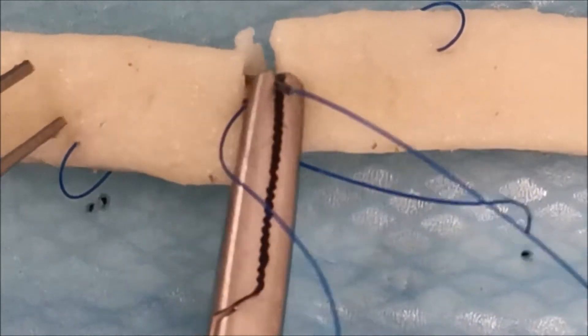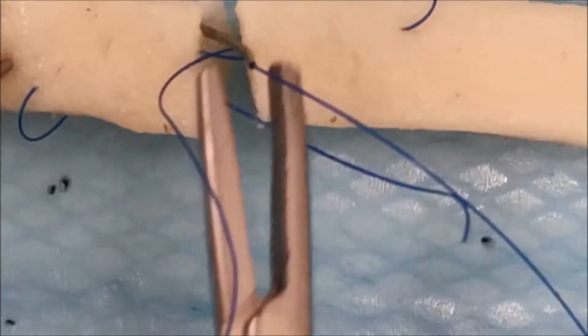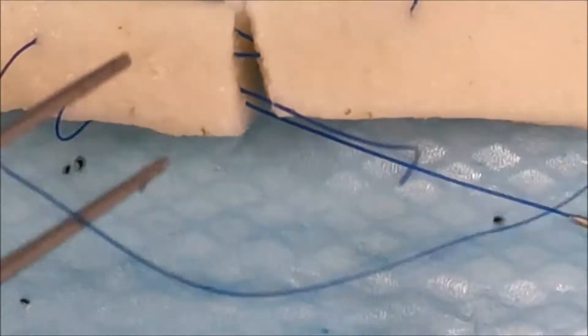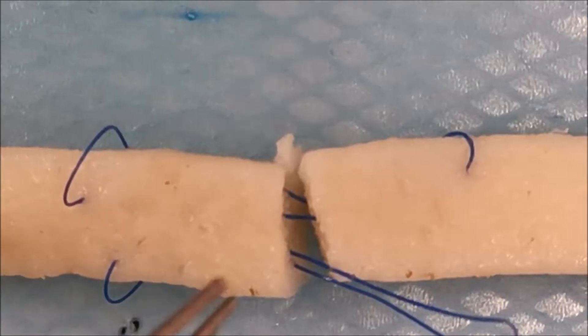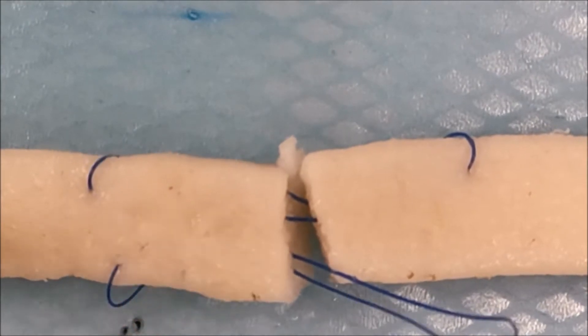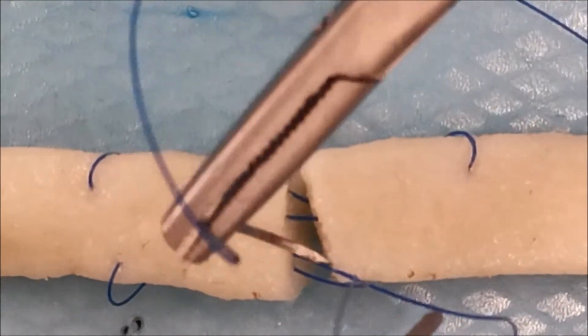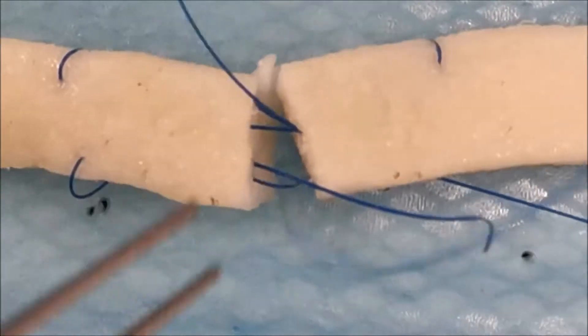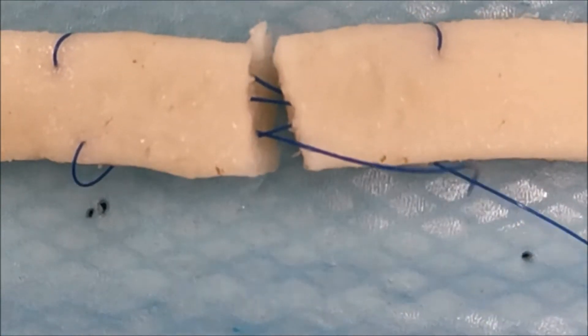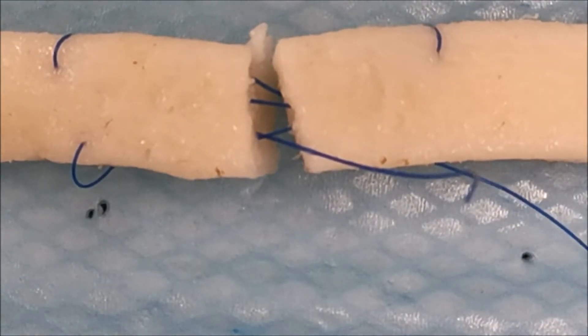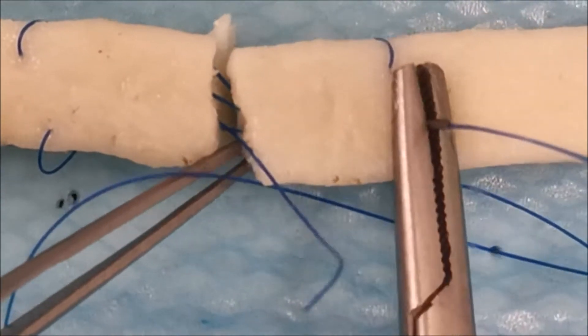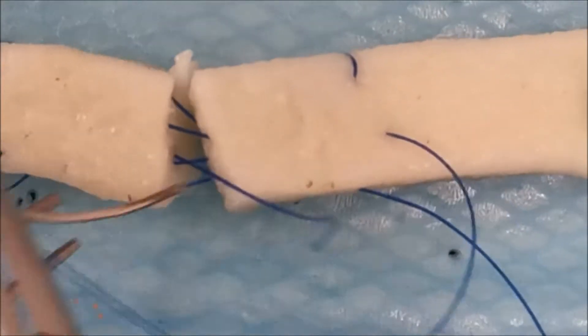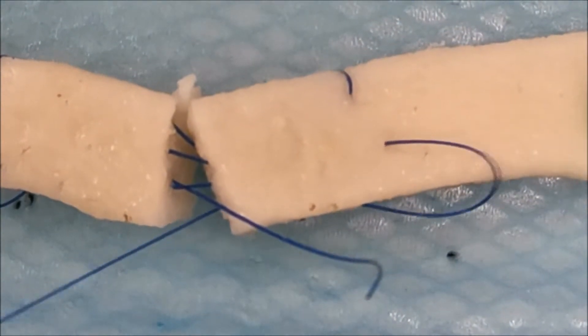The same is done on the other side. A variation of this is the Adelaide repair which is similar to this but each corner is locked. If you use this repair, it will be more difficult to glide at the end of the repair. Whereas with this one, it does not lock, and when you tie your suture at the end, you can control how much bunching or tightness you have in your tendon repair.